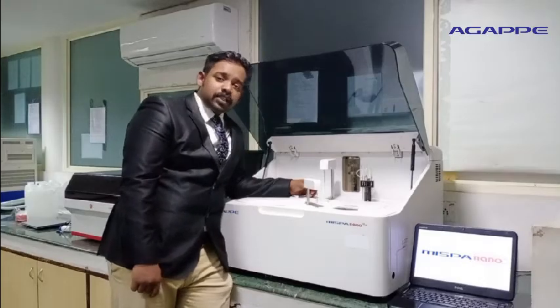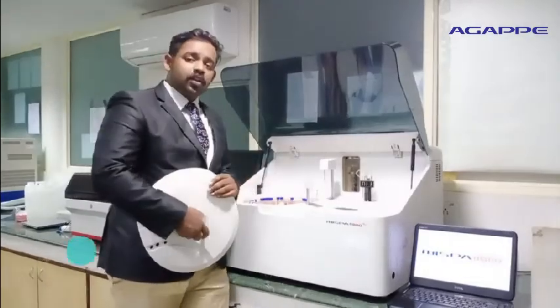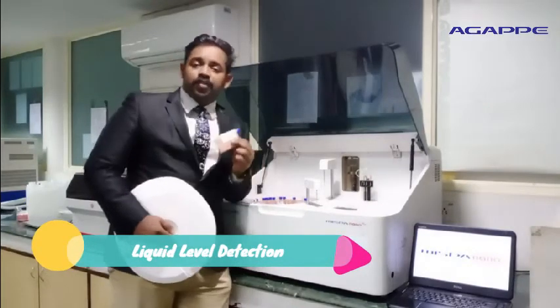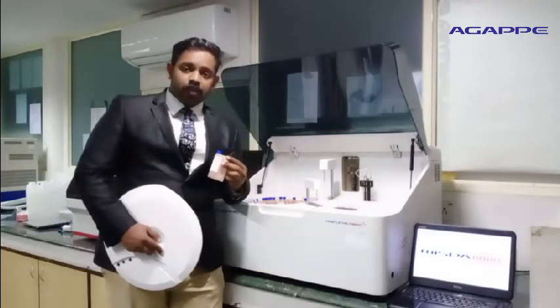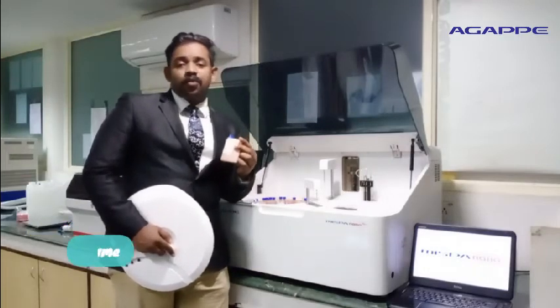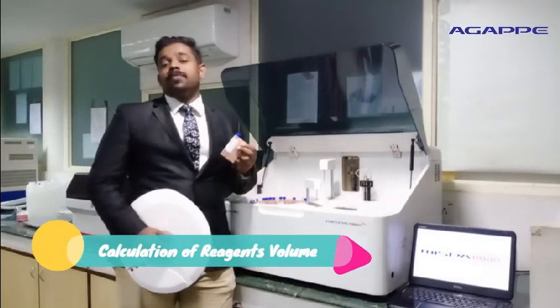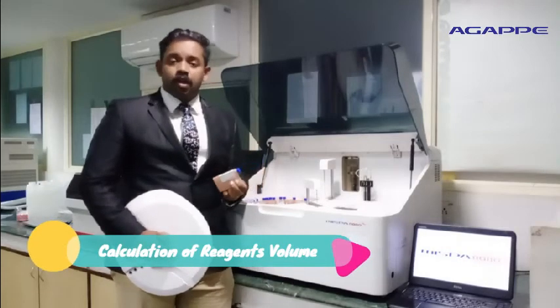Apart from the aspiration and dispensing function, the multifunction probe is incorporated with liquid level detection, by which the probe moves further down only if it senses liquid inside the reagent bottle or the sample container. In addition, the software can calculate the volume inside the reagent bottle and tell you the number of tests remaining with that volume. This helps you in planning the reagent inventory as well.